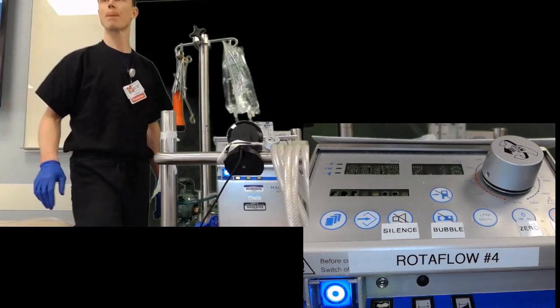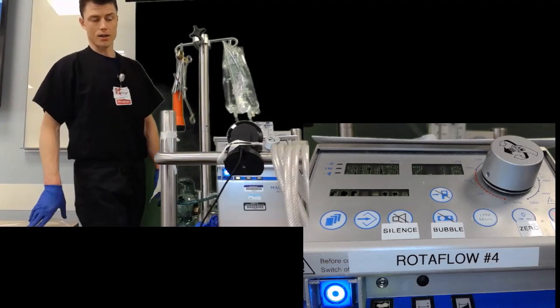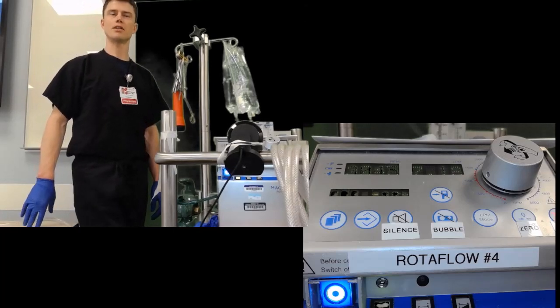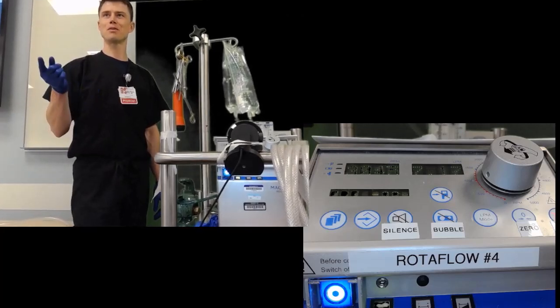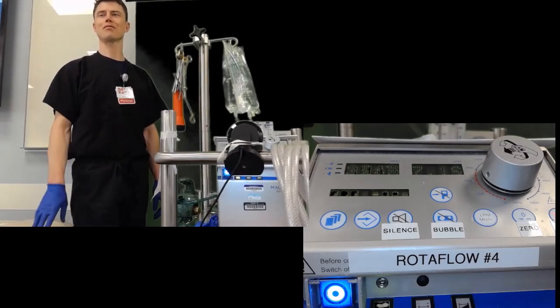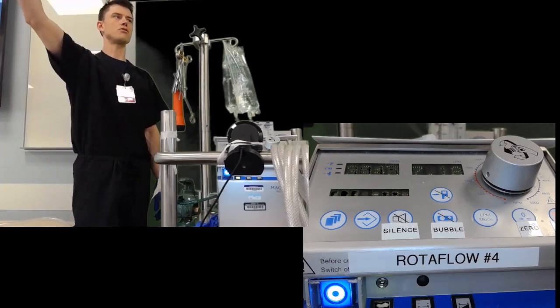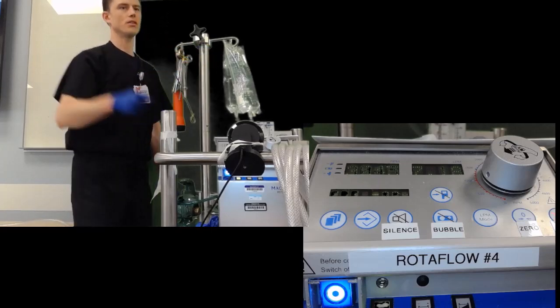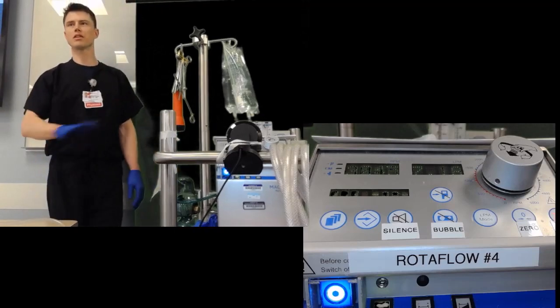How much reserve is it supposed to have, like, if you're traveling? I think it's supposed to have a couple hours, but we had one patient. We were in the basement coming from CAT scan to the ICU, and we had to literally jump from plug to plug to plug because the battery malfunctioned.